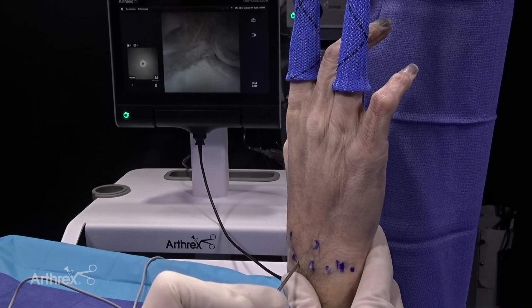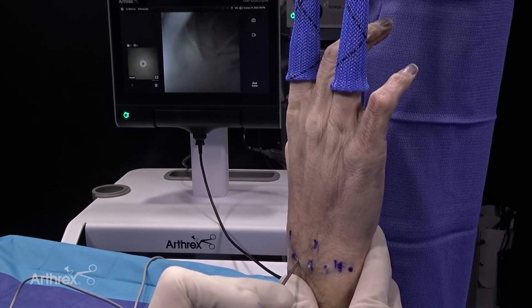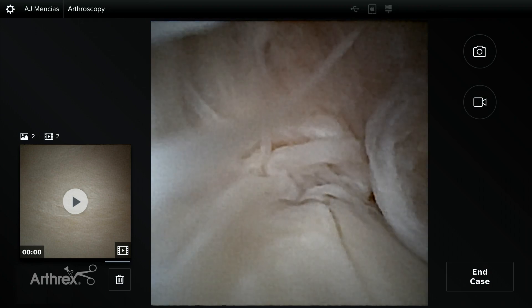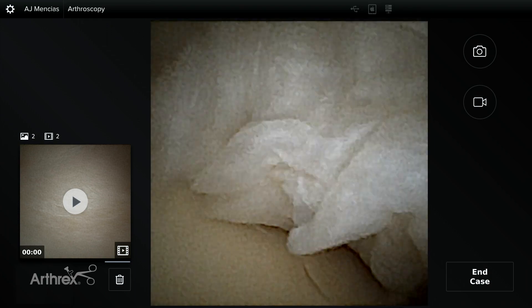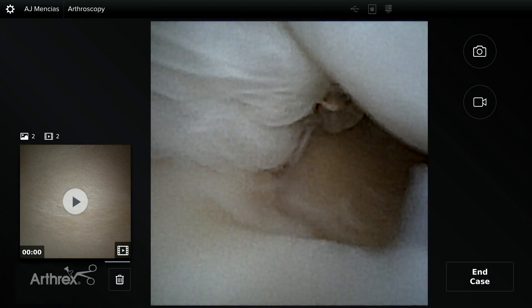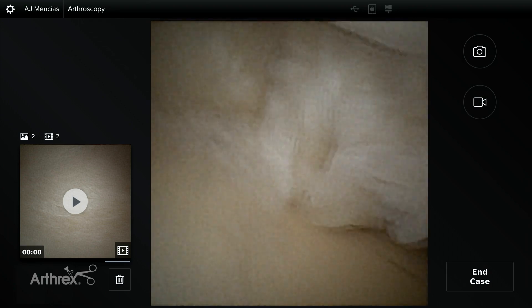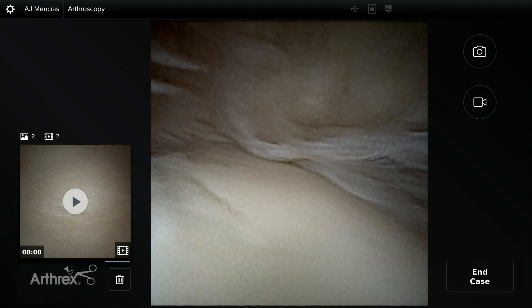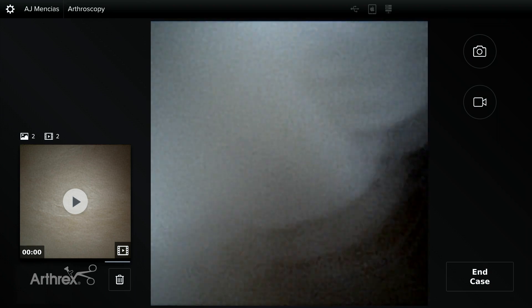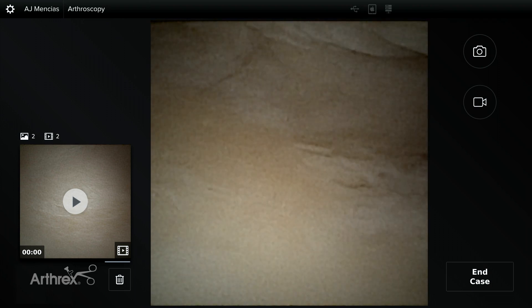For those of us who have done a lot of wrist arthroscopy, I can promise you it is hard to get this far radial in the wrist. I'm already noticing that the field of view and the ability to be precise in diagnosis and treatment with the nanoscope will be a huge advantage — technology we're only beginning to explore. Just the ability to maneuver around the wrist is unbelievable as I pull back, studying the scapholunate ligament, the volar extrinsic ligaments, the radial styloid with frayed synovium, and there will be a significantly decreased risk of chondral damage with this technology.